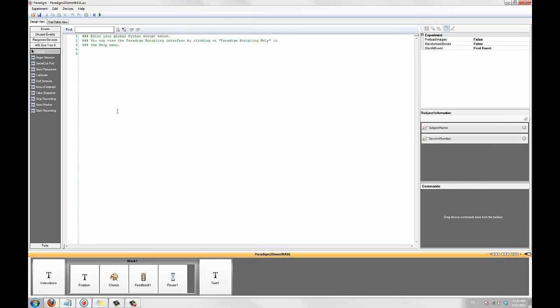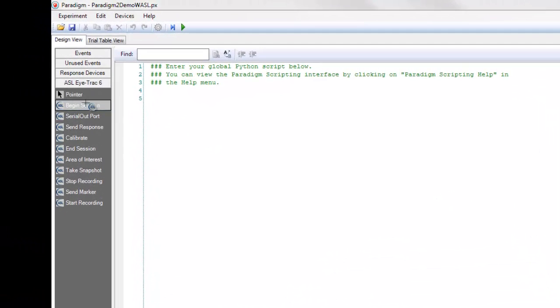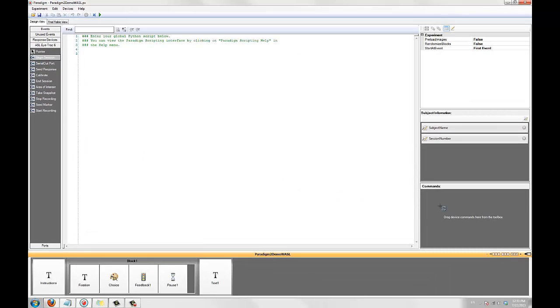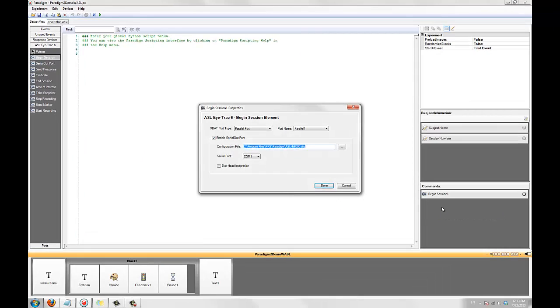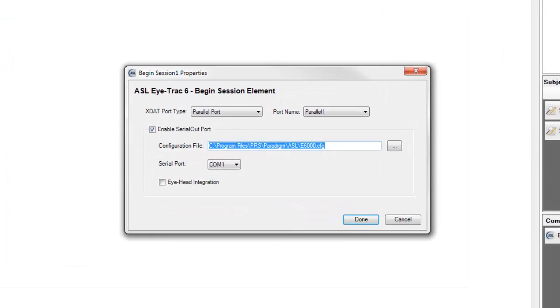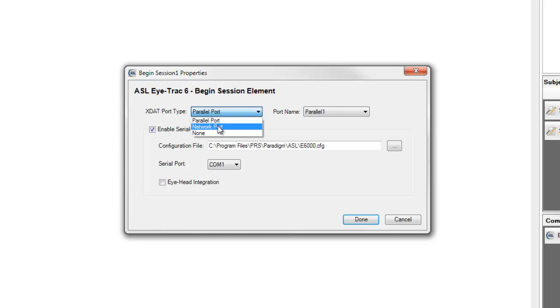To add the begin session element, drag it from the toolbox. Begin session initializes communication with your ASL eye tracker and must be added to every experiment that integrates with an ASL. We are using the network port, so I'll select network port from the XDAT port type and leave the port name network port 1.